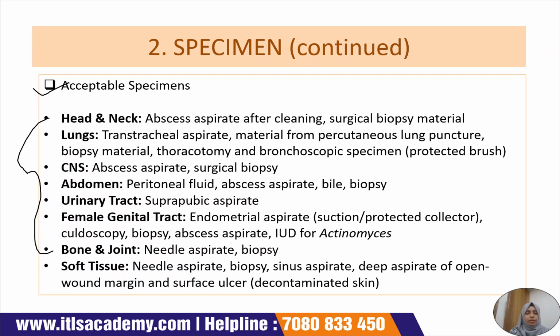Okay, and the central nervous system, abscess aspirate is considered the best specimen, and the specimens taken from surgical biopsy. From abdomen, peritoneal fluid, abscess aspirate, bile, and biopsy specimens are generally considered good.